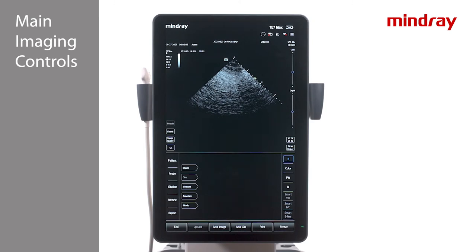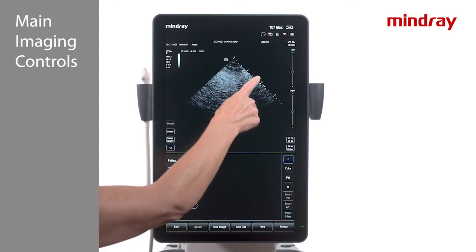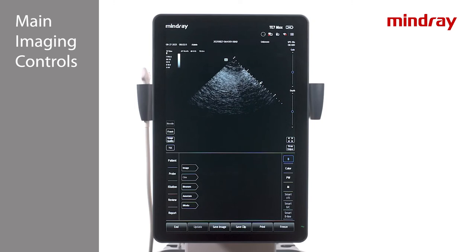The green caret on the right side of the image is the focal zone. Move the caret by holding and dragging either up or down. The location of the green caret is the zone where the image will have the best clarity.